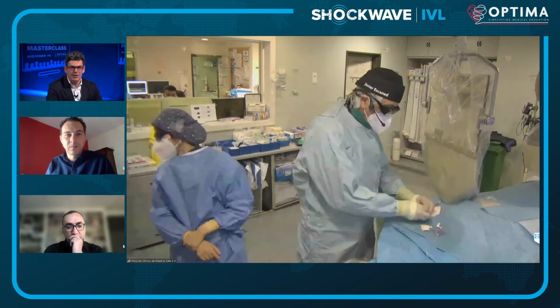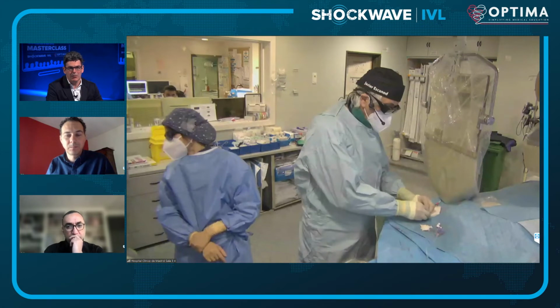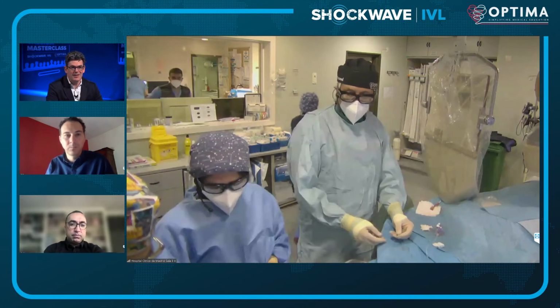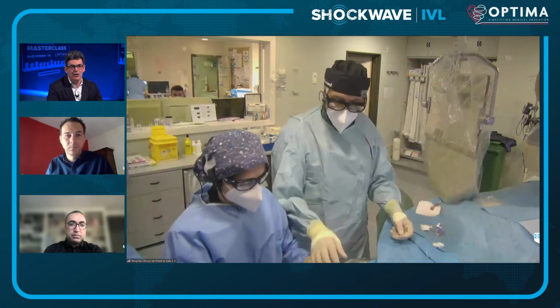And my experience with going in with a high-pressure balloon in this scenario is that if you have unmodified calcium, we often see after stent implantation that you push a boulder of calcium through the wall. So to avoid that risk of perforation, further calcium modification with shockwave, I think, is indicated here.